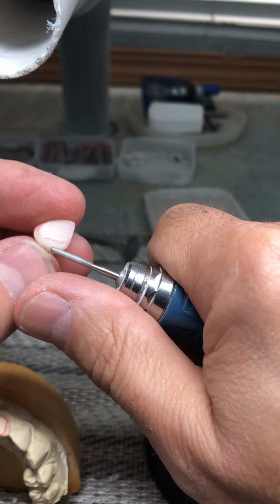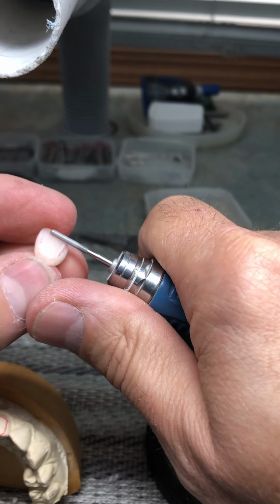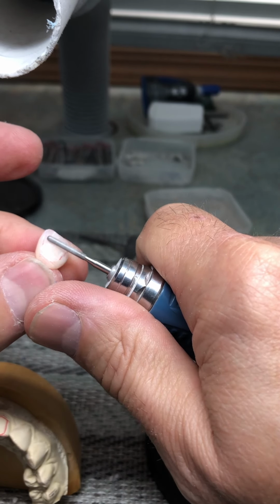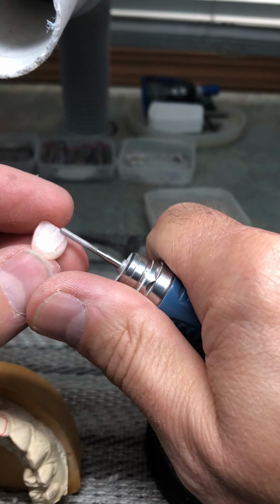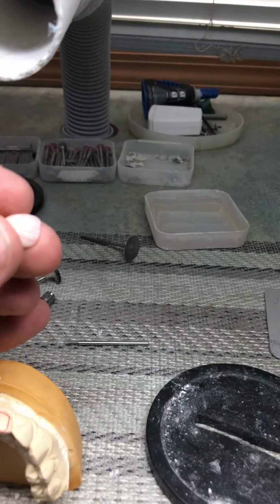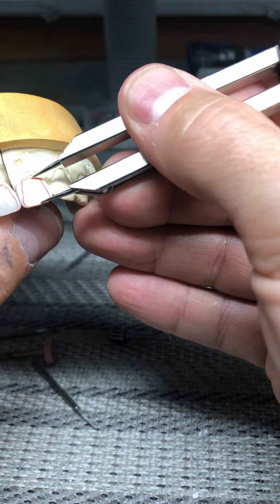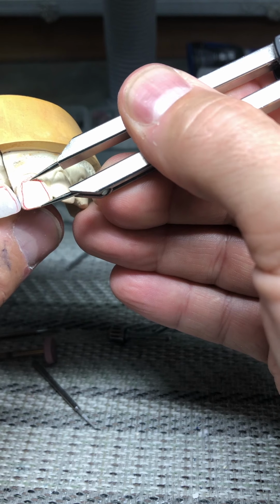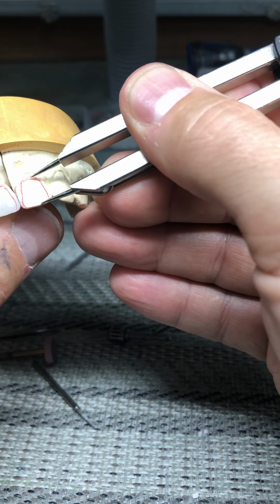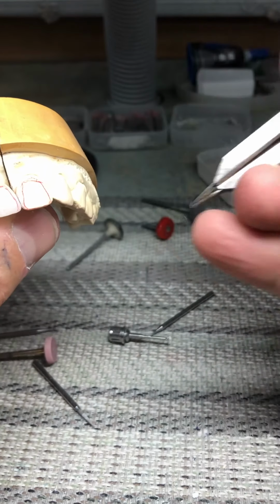The area where this really tapers back on the distal is key to the contour of this crown. Also putting in some of my vertical surface texture. And let's see where we are here. The apparent length right in the center of the tooth, not zenith to incisal, but right in the center, we have it just about right.